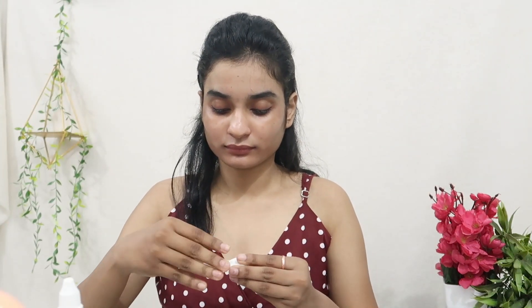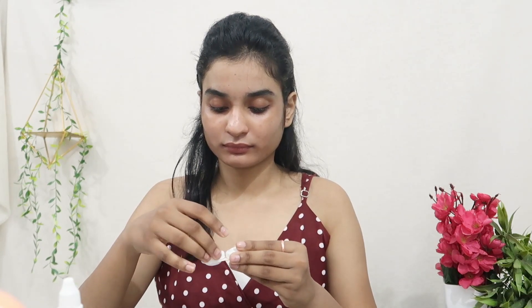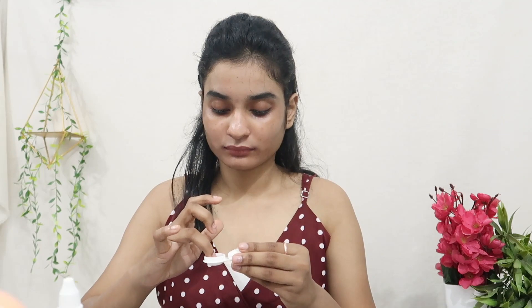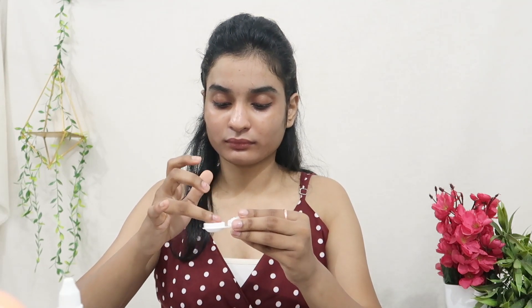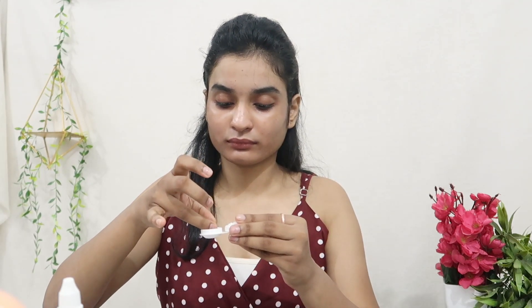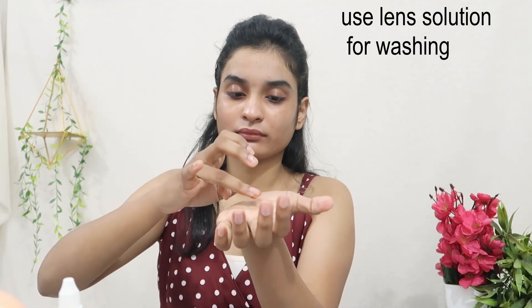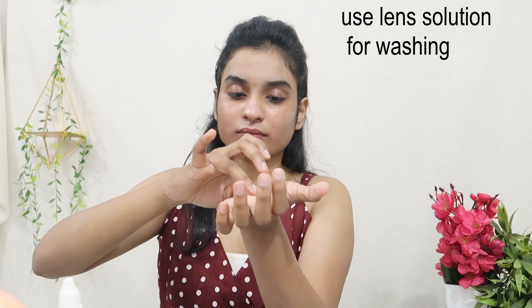Without wasting any time, let's get started. This is my lens container and it is in solution. Make sure your hands and lenses are both clean, otherwise it can harm your eyes. My lens shade is brown and this is a new lens, so I will not wash it.